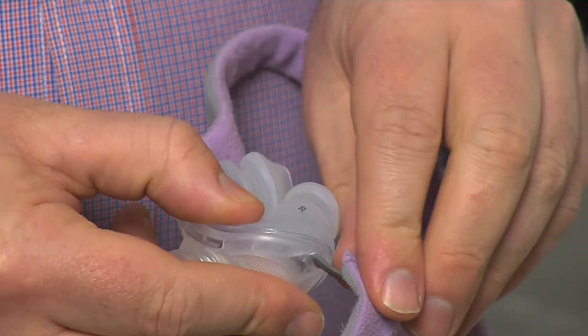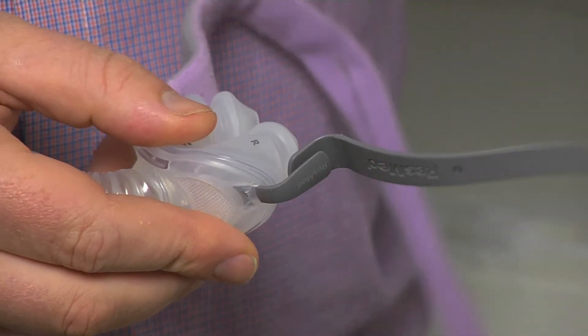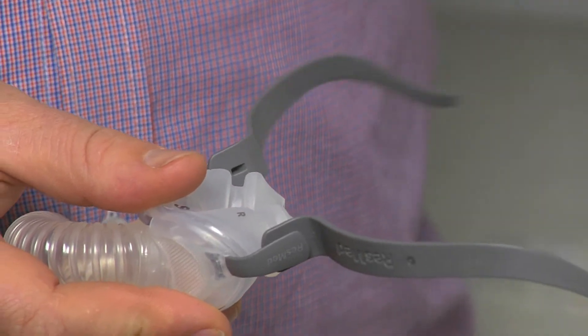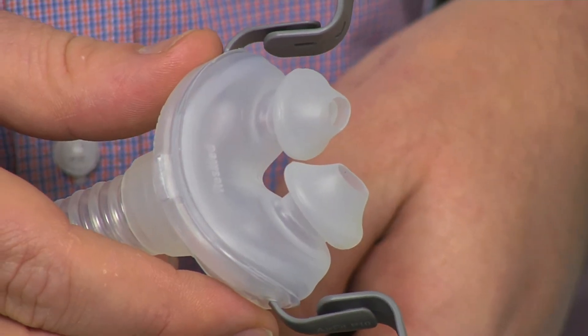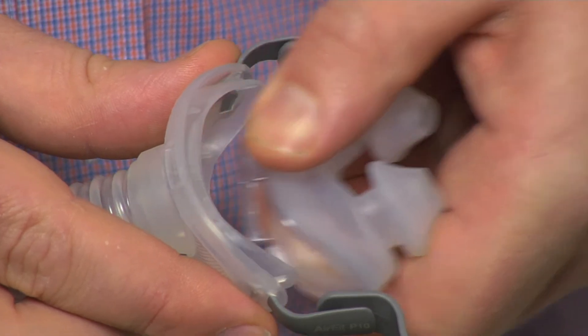The process for changing the headgear is quite easy. All you need to do is remove the headgear from the frame and it slides off with ease. This may now be a very good opportunity to give your mask a thorough clean. To take the pillow component of the mask out, simply unclip by squeezing together and pulling out.